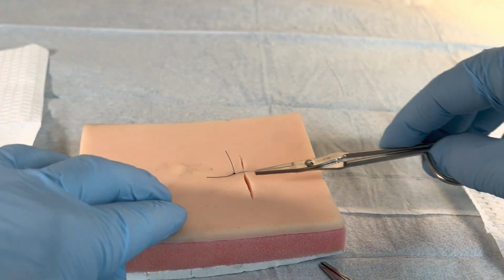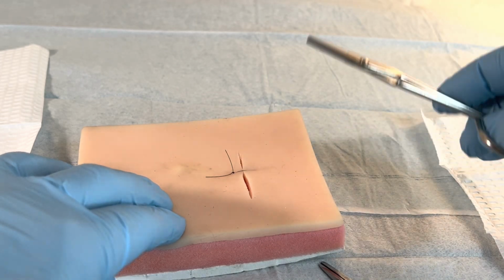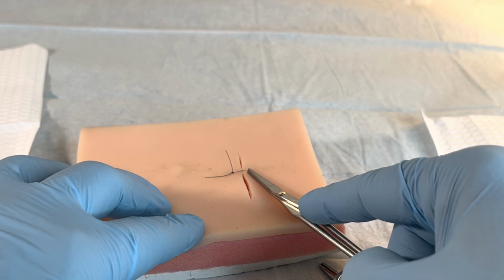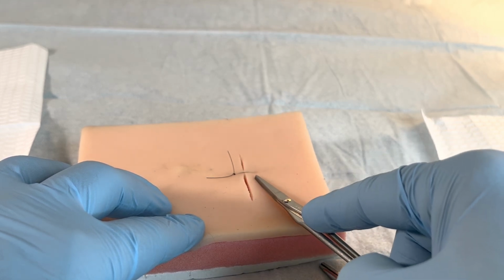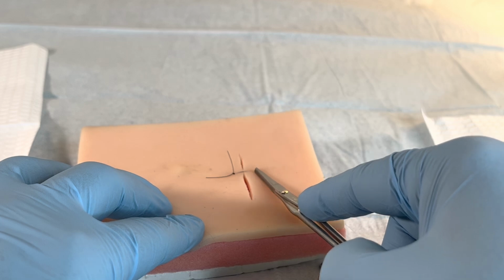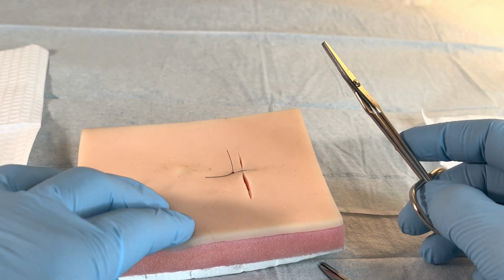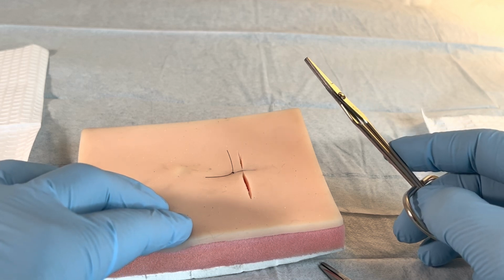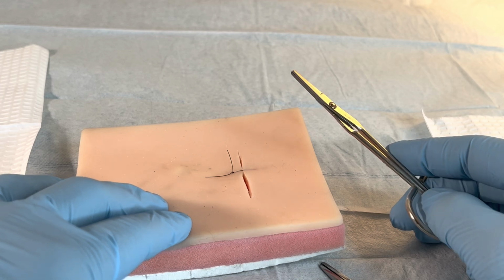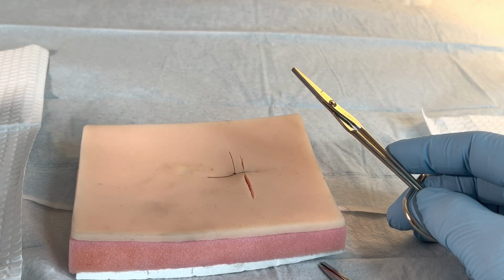Then we could repeat again, either splitting the distance on both sides, or as we'll discuss in another module, some people like to take the space between sutures as 1/2 of the distance from here to the edge. That's getting a little more into the weeds and perhaps a bit more appropriate for higher tension or surgical sutures, but depending on the patient, depending on the wound and the location, absolutely could be appropriate for the urgent care setting. So that is our instrument tie.